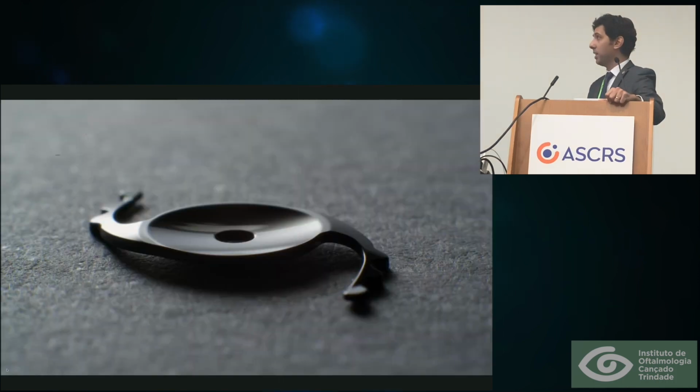Another important point here is the posterior face of this implant. Here we can see the vaulted haptics, which is an important characteristic of sulcus lenses. But also, the occlusive portion on the posterior face has this meniscus shape to avoid contact with the primary IOL.